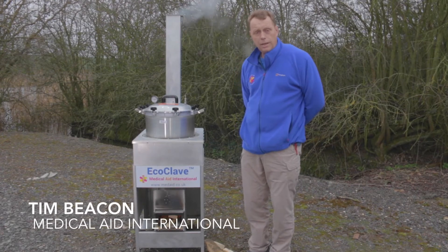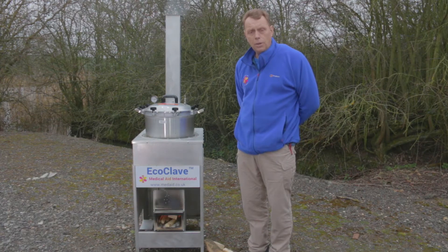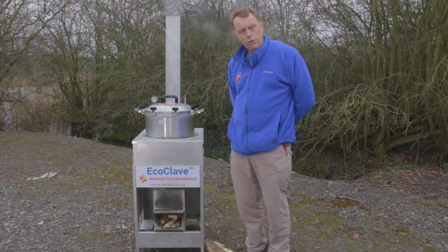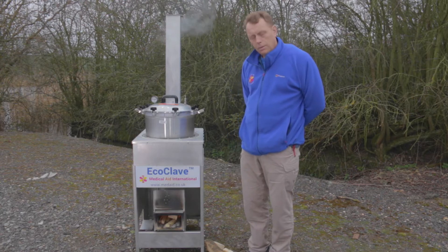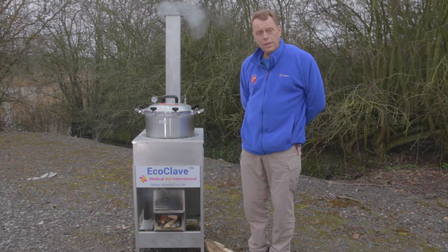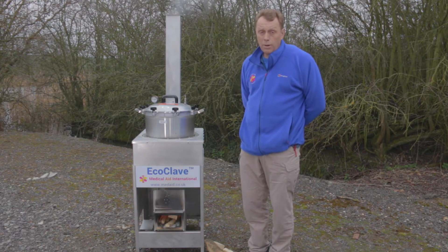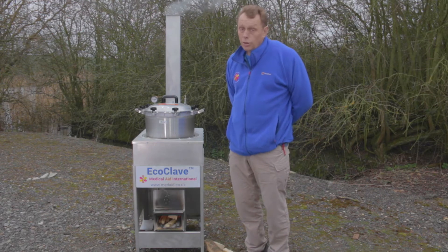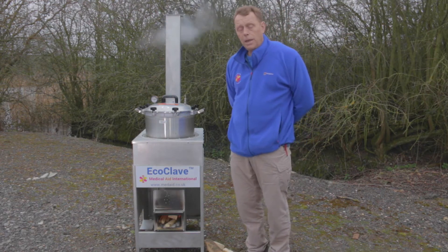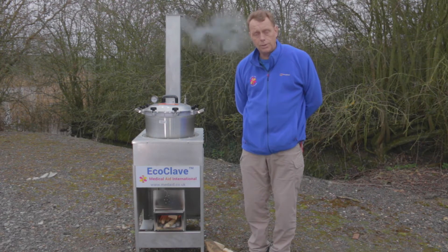Hi, my name is Tim Beacon from Medical Aid International. Our work supporting healthcare in the developing world often brings us into situations where there's no electricity in rural clinics. One of the problems that local healthcare providers face is how do they sterilise their equipment. Commonly, all that happens is that on a good day the instruments are boiled, which does not sterilise things — it feels good, looks good, but bacteria still exist on the instruments.